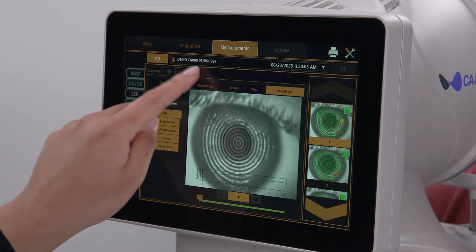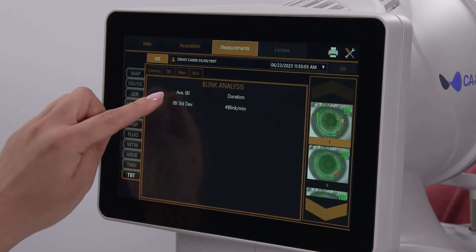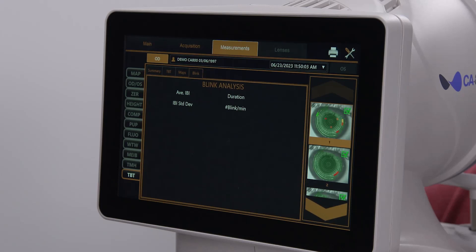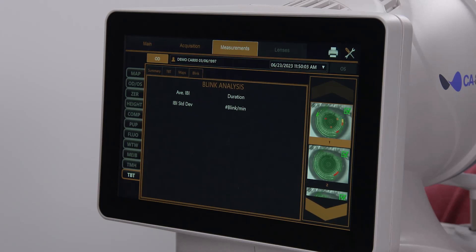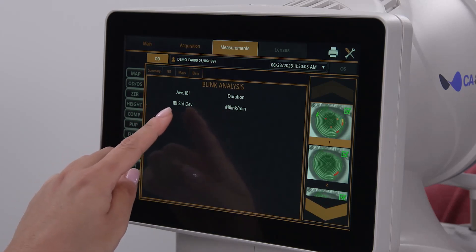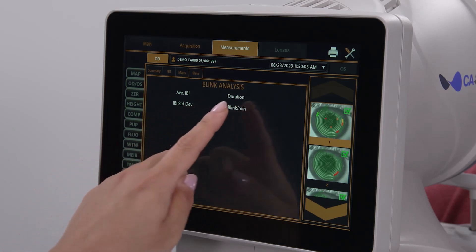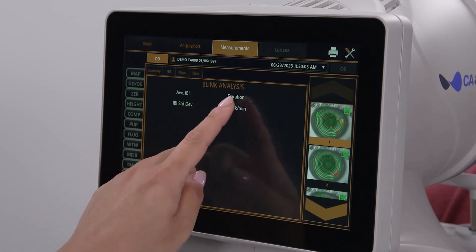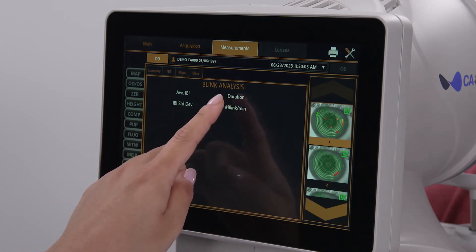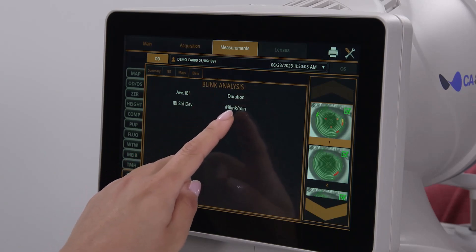The Blink tab provides metrics from the blink assessment including the average inter-blink interval — that is, the average amount of time between blinks — the standard deviation of that value, the duration of the blink assessment acquisition, and the number of blinks per minute. For more information, please go to TopConHealthcare.com.